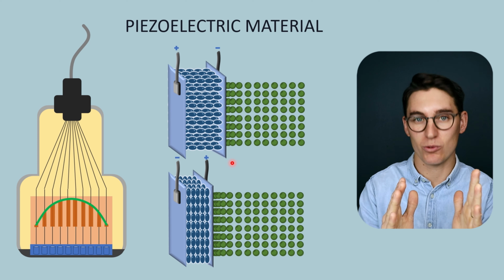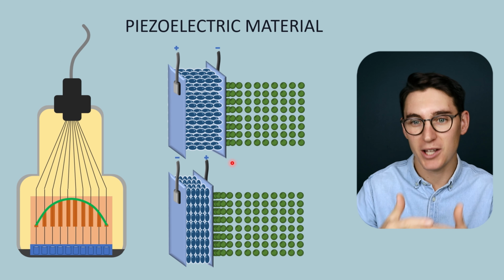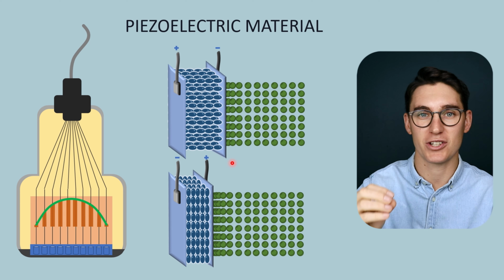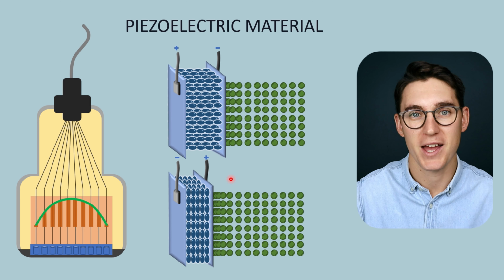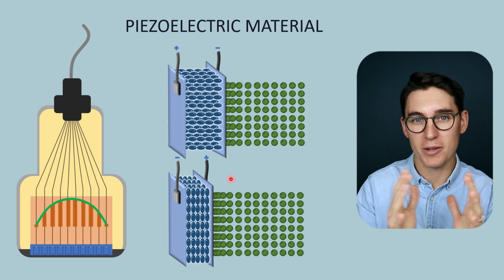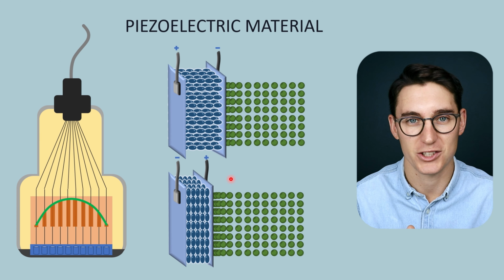Now we can either run an alternating current and cause that shape change to happen continuously, propagating a wave at a set frequency through a tissue, or we can apply a large electric current over a short period of time over this PZT material, and that PZT material will then resonate at a set frequency. And it's that resonance of the PZT material that will cause the sound wave to propagate through our tissues.